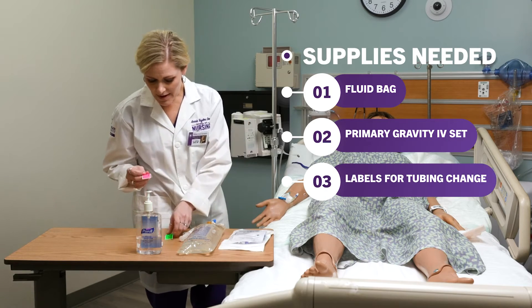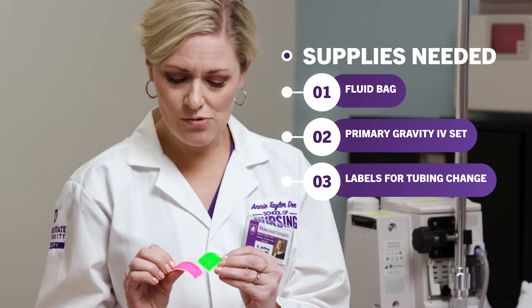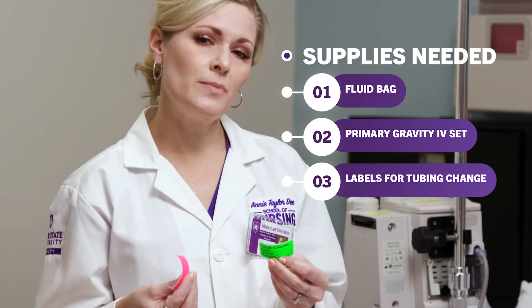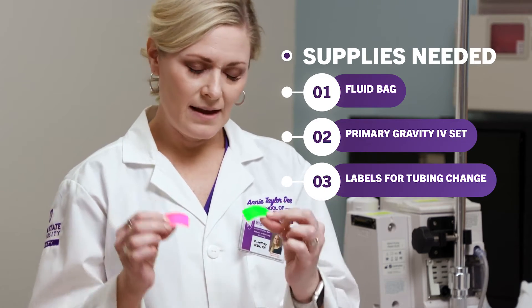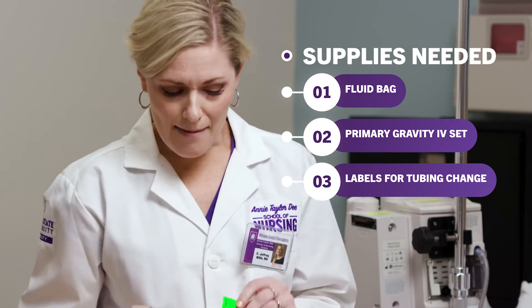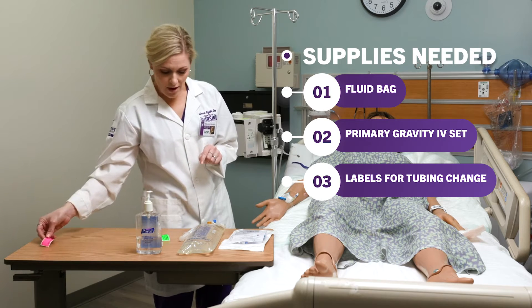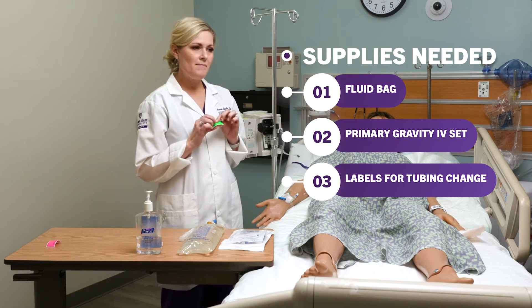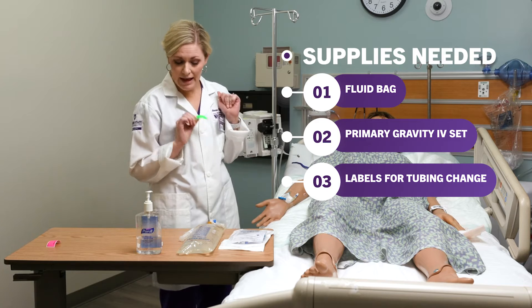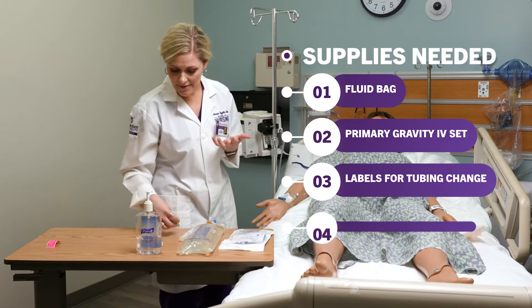I'm going to grab some labels. Some facilities have policies on how often to change out your tubing. This one is a 72-hour change and this is a 24-hour change. I'm going to use the 72-hour change for my primary line and keep the other for our secondary line. I'm going to label it with the date I hung my line so that whoever's on the next shift will know how long that line has been there.